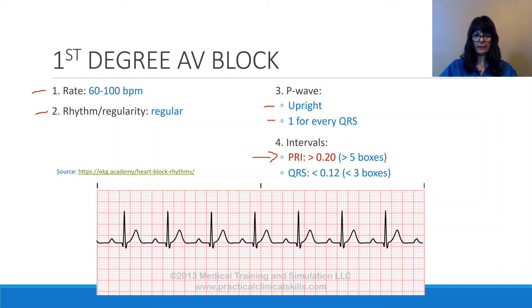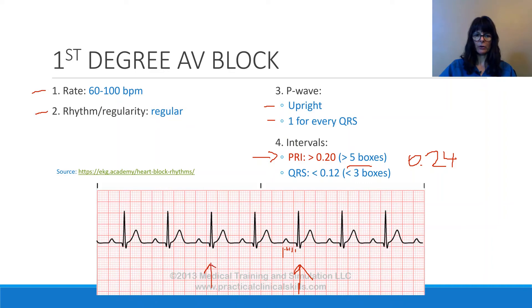If we look at this fifth impulse here, we can see the P wave starts at this thick line. Counting the boxes — one, two, three, four, five, six — at least six boxes, which corresponds to 0.24 seconds. That confirms this is greater than five boxes, representing the conduction delay through the AV junction. The QRS is also measured here starting at this line — one, two, three — about two boxes, which equals 0.08 seconds, less than 0.12, making the QRS normal.